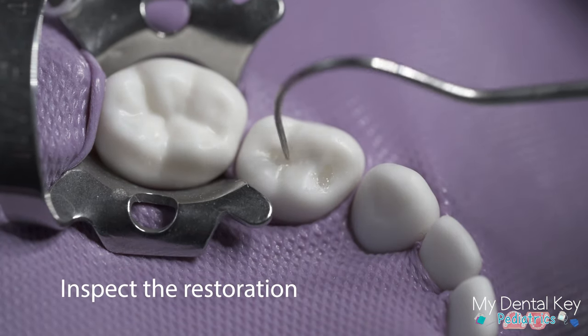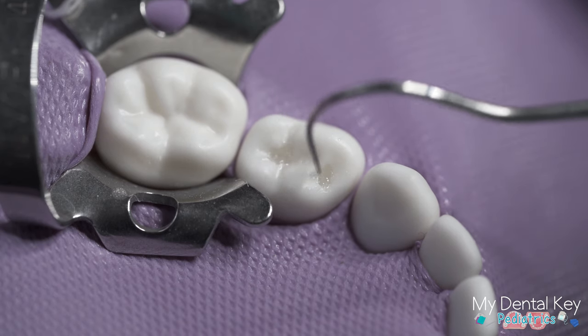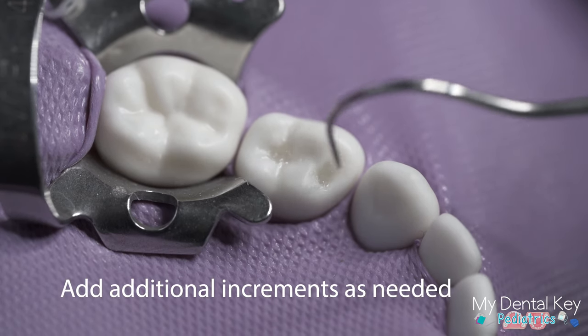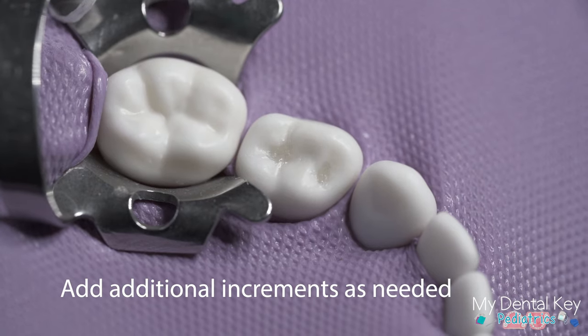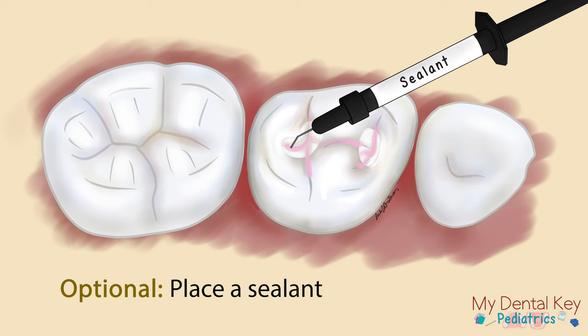Inspect the restoration and look for voids, flash, or inadequate marginal seals. At this time you can add composite, continuing to add in increments of 1 to 2 millimeters and light curing between each increment. You may optionally place a sealant over the composite restoration, as sealing over the restoration has been shown to decrease microleakage and increase the longevity of the restoration.